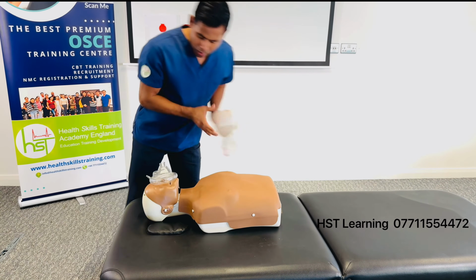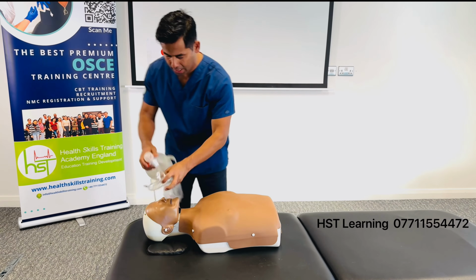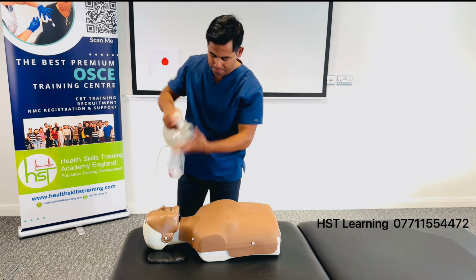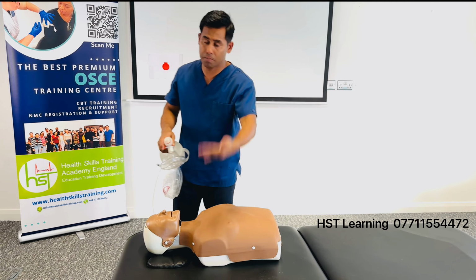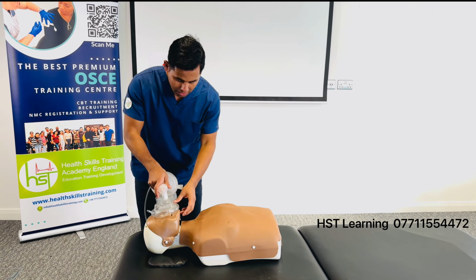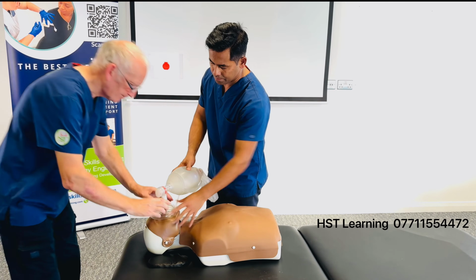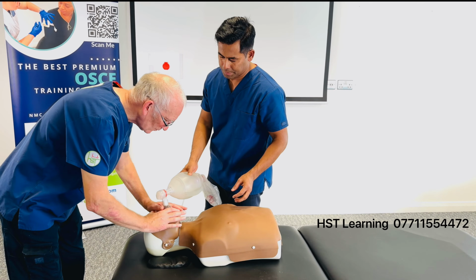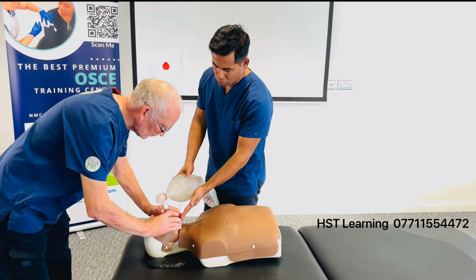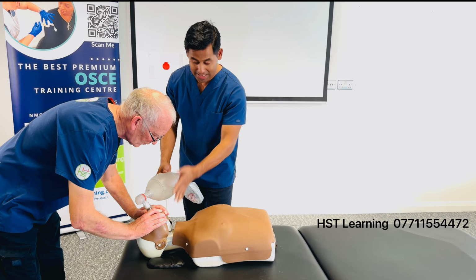So the ambu bag will be connected. If it falls off, don't worry, just pick it up and connect it nicely here, because in an exam situation under pressure, the ambu bag might come off. Just pick it up, connect it and seal it nicely. Can I please have you hold there? Okay, and can you tilt the head back for me, please? So now it's nicely held and it's sealed properly.